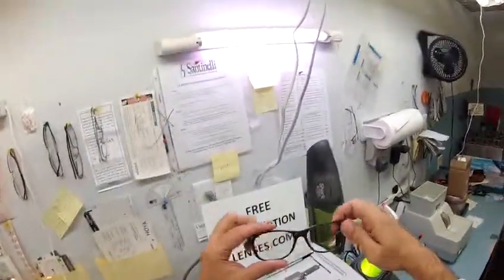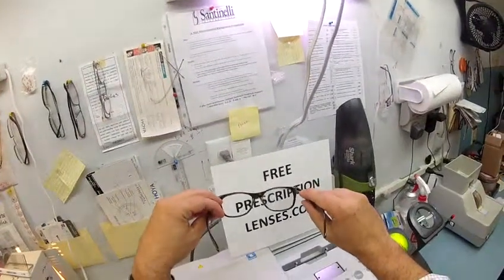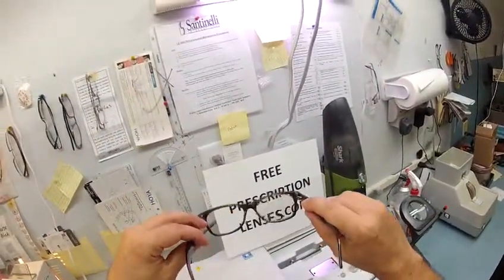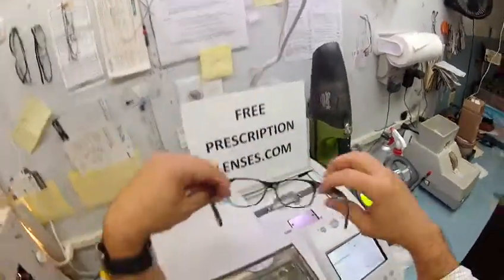So, at your request, there is no prescription in the top and plus 150 in the bottom. And as I move it over, the words and the lettering in the background, you should see the magnification really take effect. Nothing in the top, only magnification in the bottom.